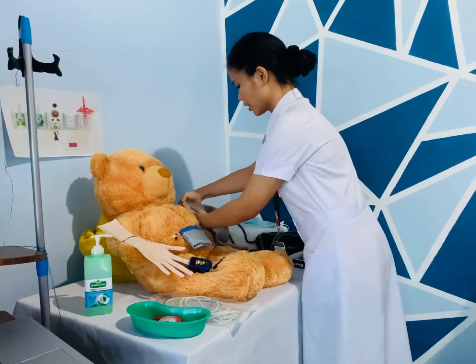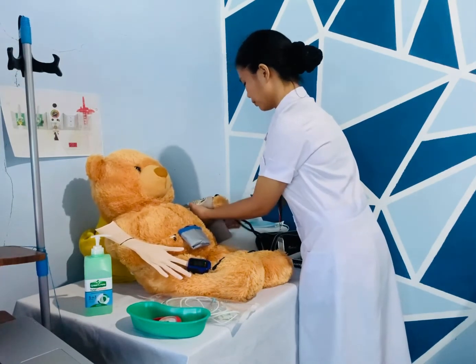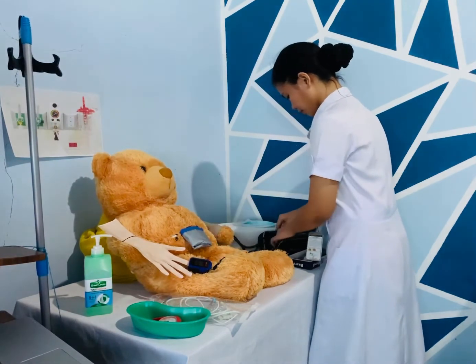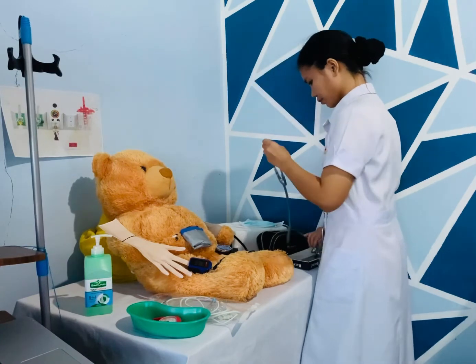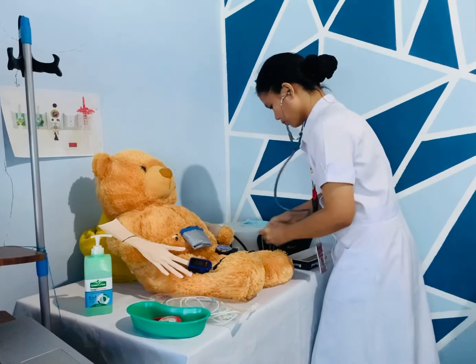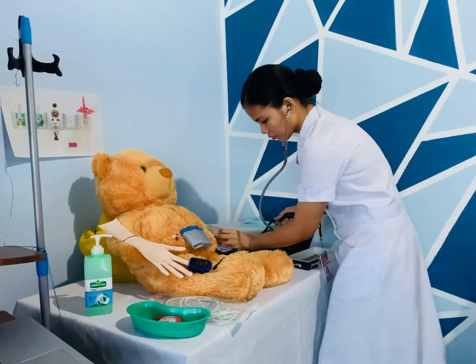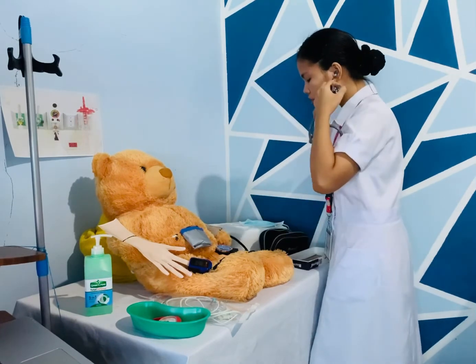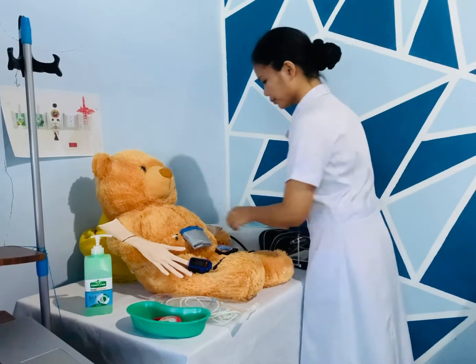Relax lang po kayo dyan. Okay. So, after that, document the result in the record book.